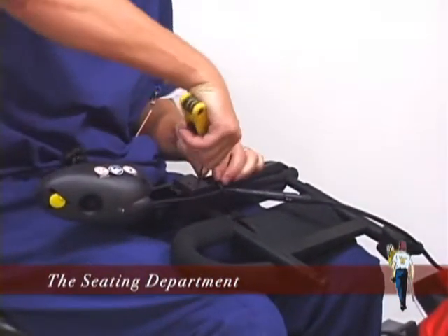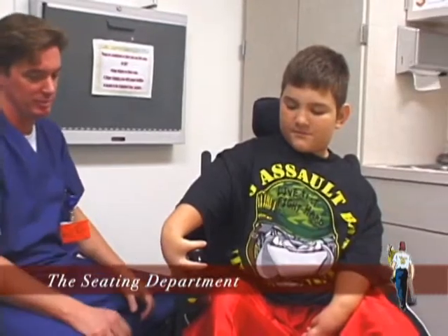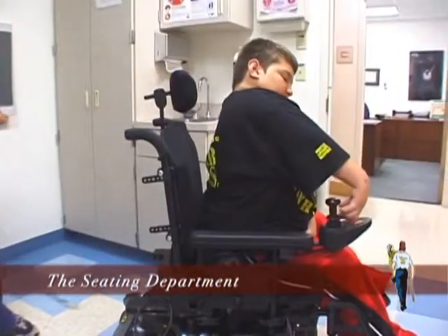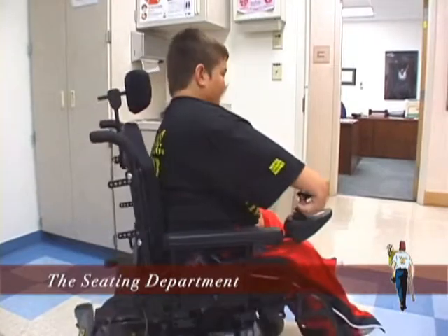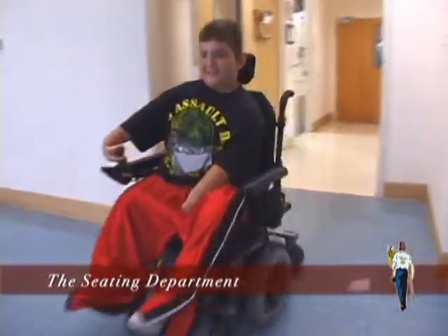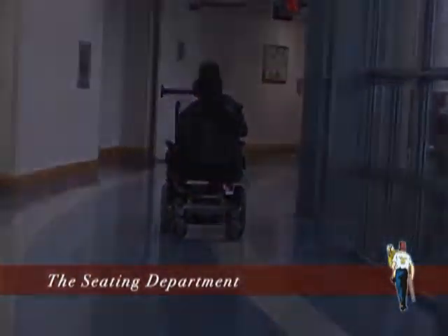Because of our open accounts with the manufacturers, we can get all of the switches and power chairs and equipment we need for testing. We've come up with a program where we actually test the child's skills on a computer with similar switches that would be in a power chair, and then we can determine what their switch access is going to be, what their accuracies are going to be, if there are any limitations. And then with that information we actually can set up a power chair that is the most probable piece of equipment that they would be able to drive.